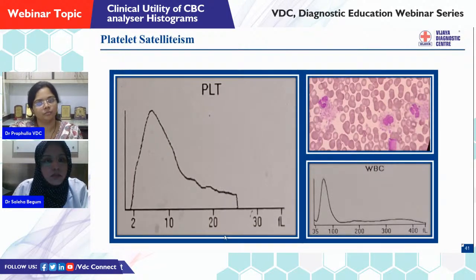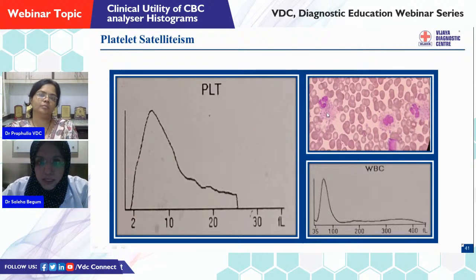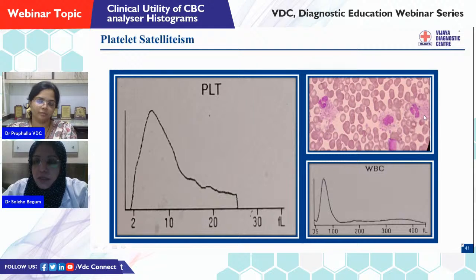Here you can see again a platelet graph starting at the baseline, having a smooth curve but not coming to the baseline. Another cause for such a graph will be platelet satellitism. Here you can see in this smear, all the platelets are forming a clump around a neutrophil. So this is a case of EDTA-induced platelet clumping, where you can see the graph is not ending at the baseline.